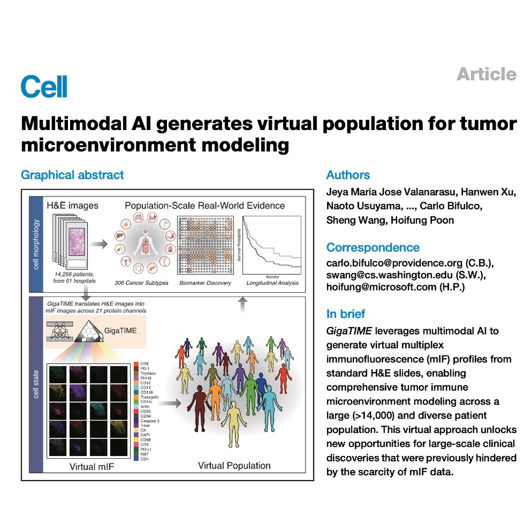The best one is the DAPI channel, which stains the cell nucleus. GigaTIME got a DICE score of 0.72, 72% accurate on the shape. The baseline was just 0.12. Wow. And for cell localization, GigaTIME hit a Pearson correlation of 0.59. CycleGAN was at 0.03, which is basically random chance. So it's clear GigaTIME is learning real biological rules, not just copying visual styles.